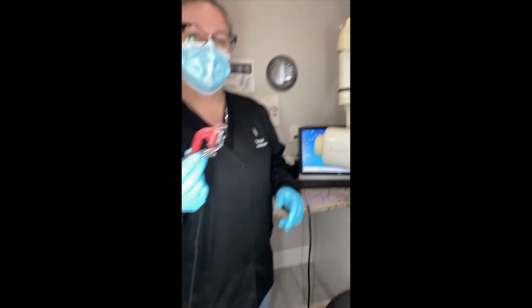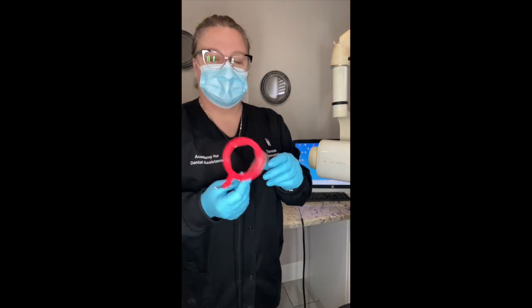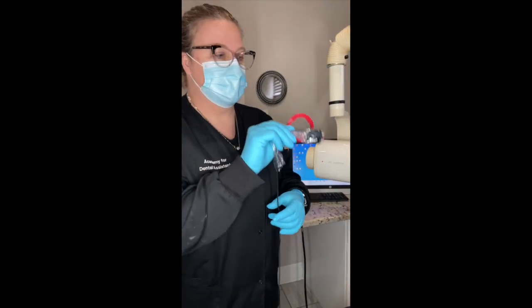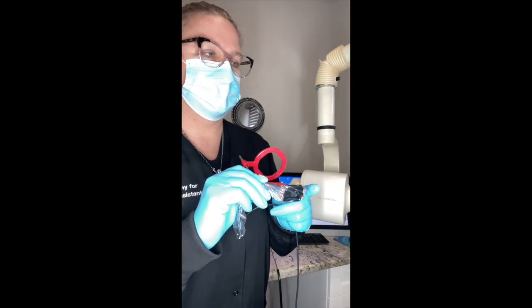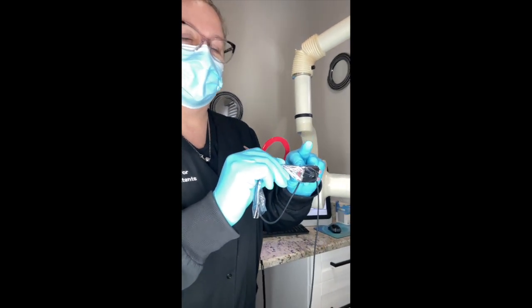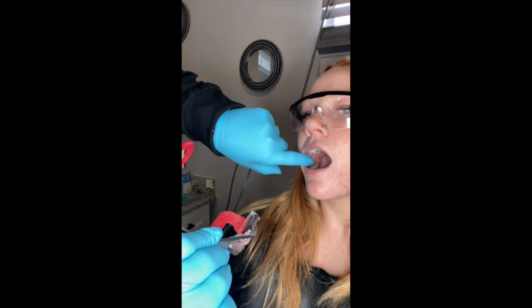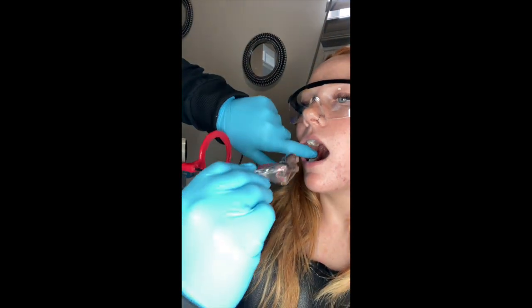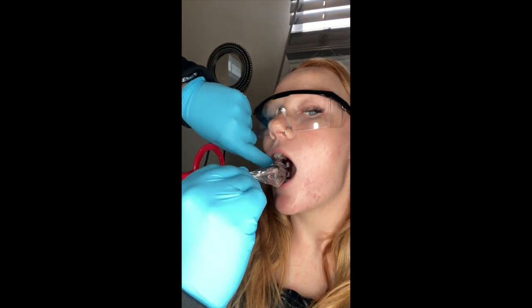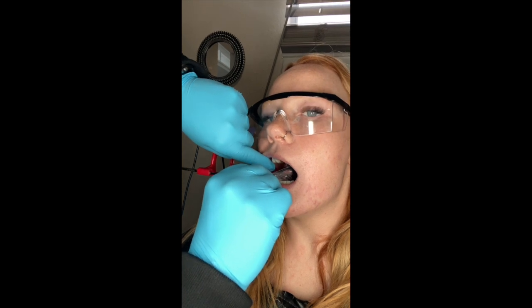Showing how to place the four horizontal bite wings. We're going to make sure the center is in the middle and place these straight in. We want to make sure we get the distal of the last molar. When she bites down she's going to bite on the bite block. Go ahead and open for me — I'm going to retract her cheek, make sure you can see the teeth. We're going to go straight in, making sure that's at the distal of the last molar. Go ahead and bite down.